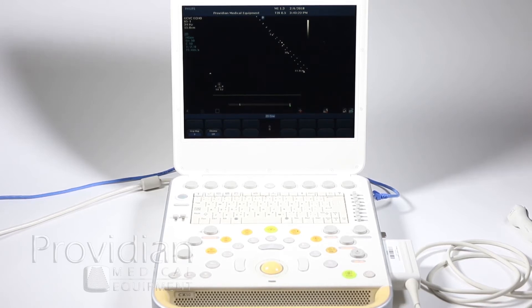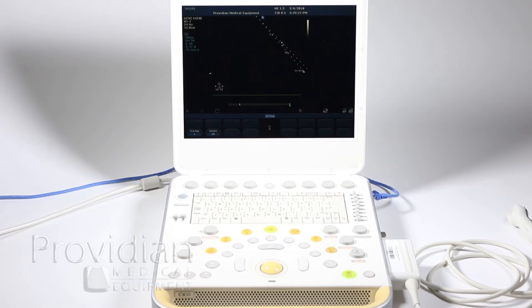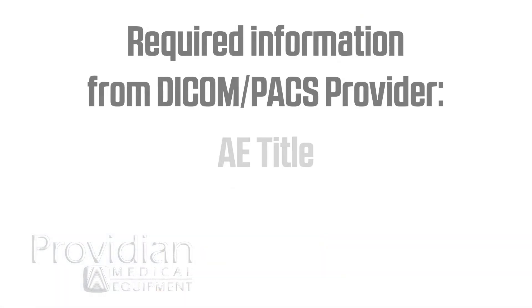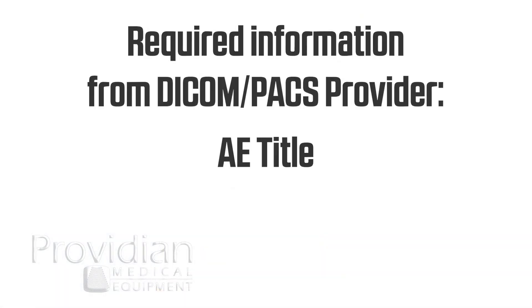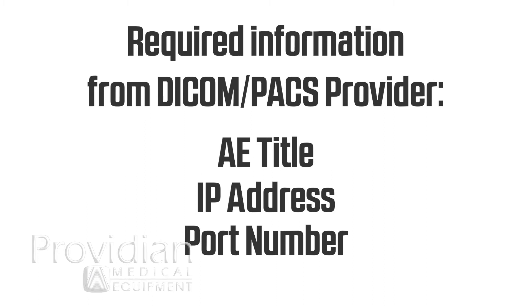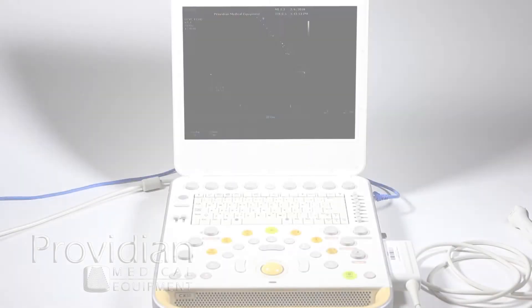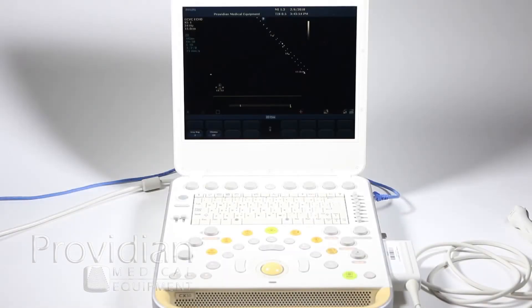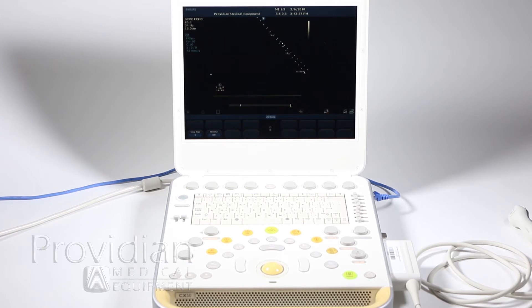Next, you need to talk to your PACS provider, your DICOM server. Whoever is in charge of that, you need to get something called an AE title, an IP address, and a port number. At a minimum, you need those three things. And this IP address is not the same IP address as they might have given you for your machine. On the PACS system, you need a separate IP address that is the address of that PACS system.